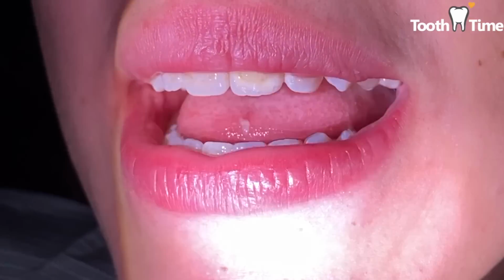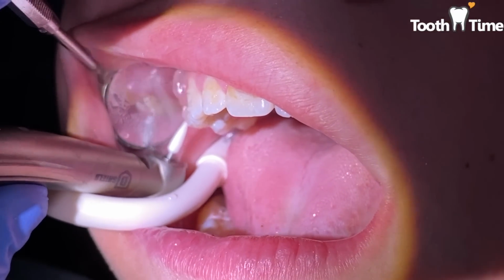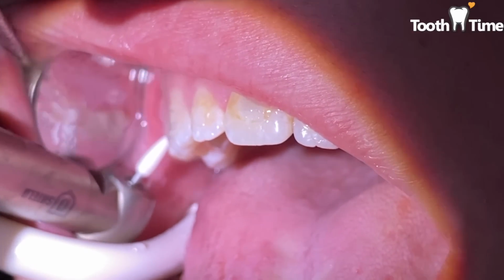Awkward. It feels really slimy. Once we take all of that off, we're gonna go ahead and remove the bracket glue with our white stone burr, and then we'll go ahead and polish everything, kind of make it all smooth.